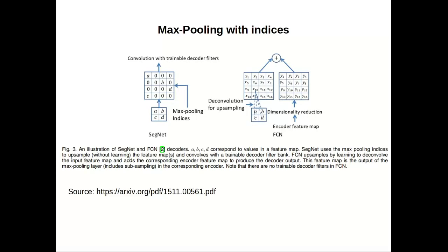Also notice that I do not use a regular max pooling operation in the encoder, nor its mirror standard upsample operation. Instead I use indices-skipping max pooling, as suggested in the SegNet manuscript from 2017. This allowed upsampling the features to their exact original location as they were before the corresponding max pooling.